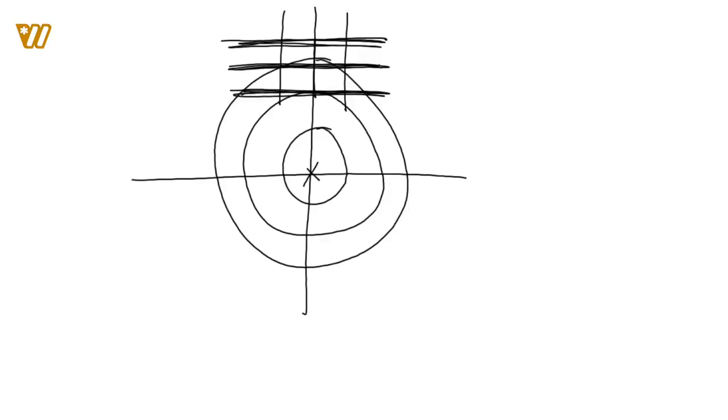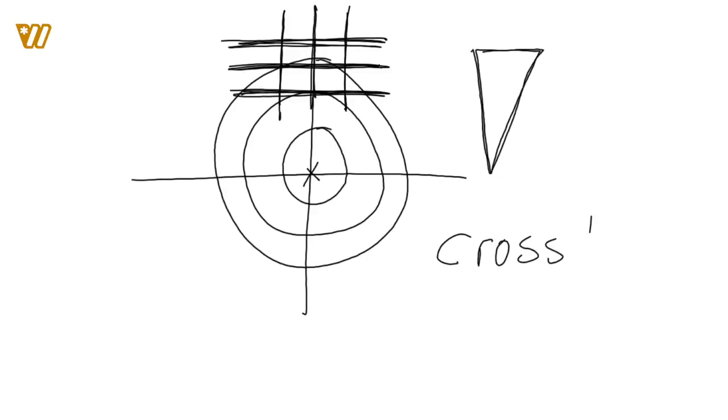If we think about their lens, looking at it like we're looking into the lensometer, if they have base up prism, it would look something like this. Whenever we think about the targets inside the lensometer, the key take-home message for you, and I think what's going to unlock this whole box, is that the crosshairs deviate towards the base. So in terms of verifying prism, the crosshairs deviate towards the base.